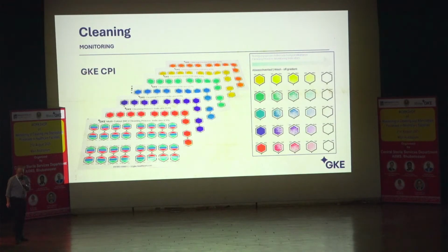We carry out tests with different test soils, and among the test soils that we use, of course, we use our own test devices that we produce on our own. We have these colored test soils. These are artificial test soils, and these different colors can be washed away. And you see, when you have a color here and you wash it over time, this is the final result. All the color will be gone and only the frame will remain on the surface.